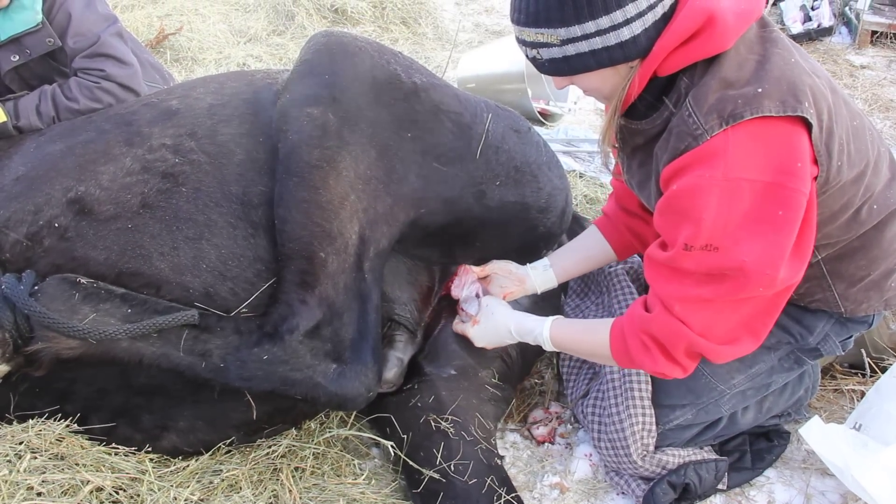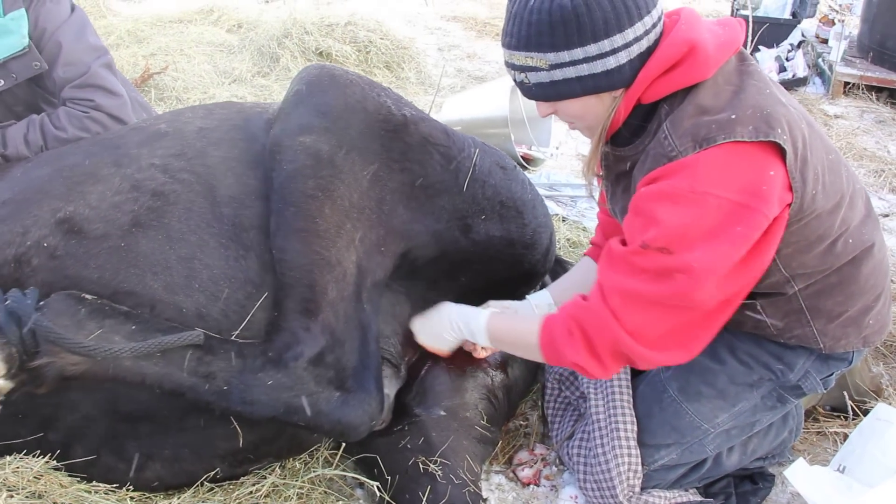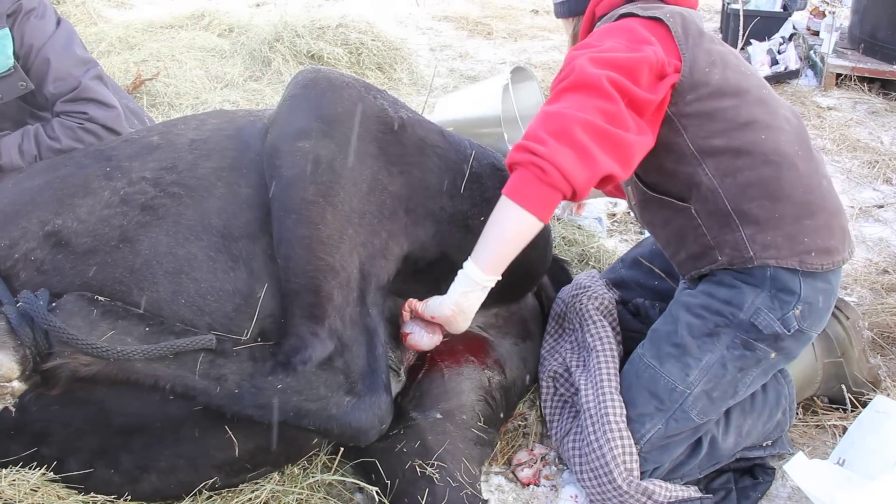I guess your hands wouldn't be too cold because you've got a warm place to put them. Yeah, they're not bad here. Let's see if his name is... Nike. You're okay, buddy.